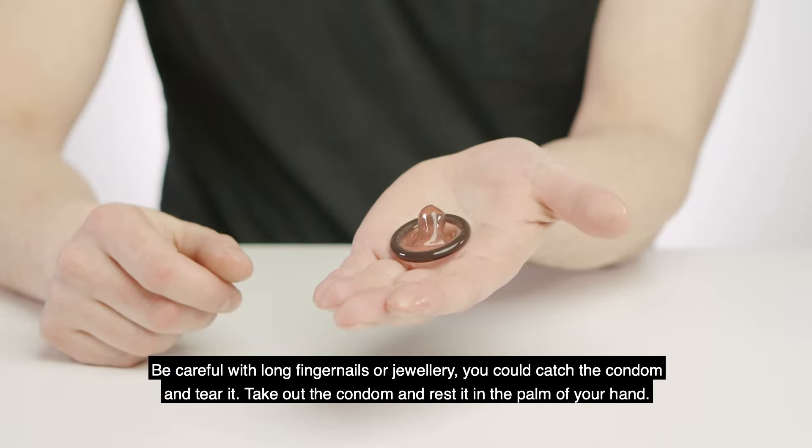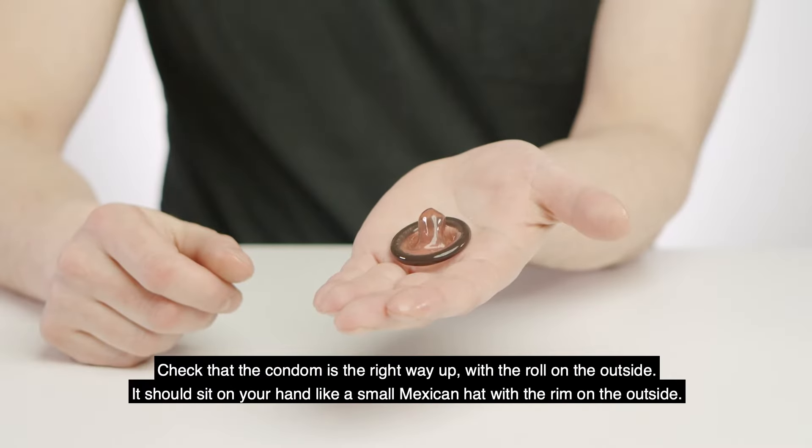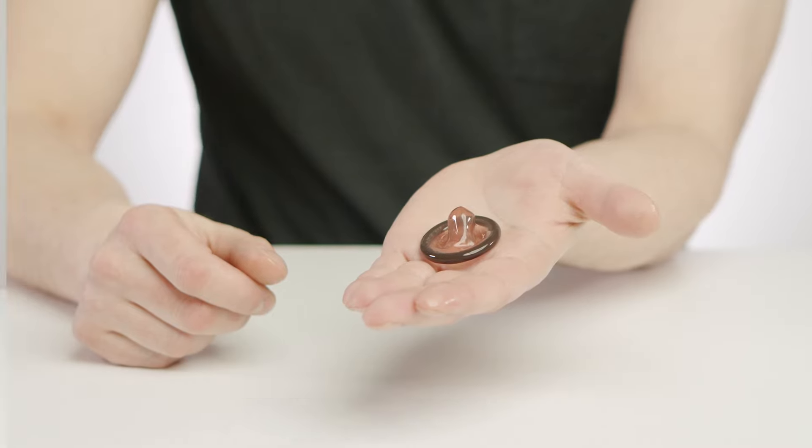Take out the condom and rest it in the palm of your hand. Check that the condom is the right way up with the roll on the outside. It should sit on your hand like a small Mexican hat with the rim on the outside. If you put the condom on the wrong way it will be difficult to unravel.